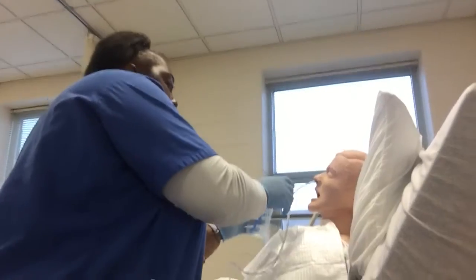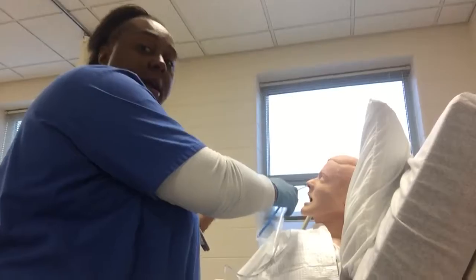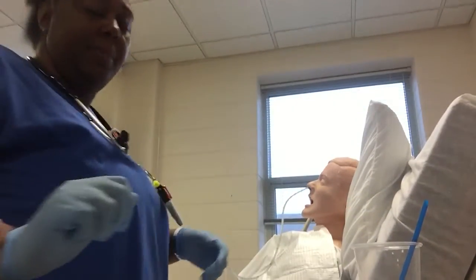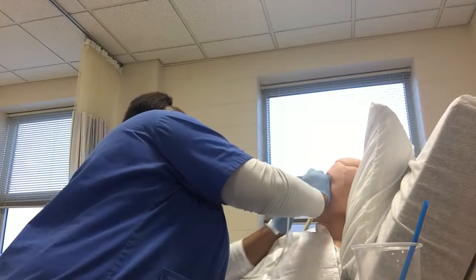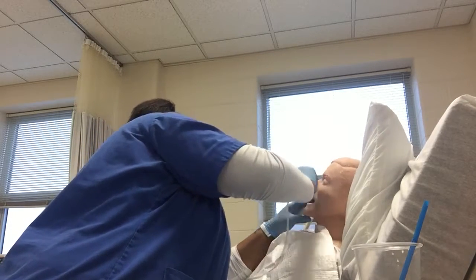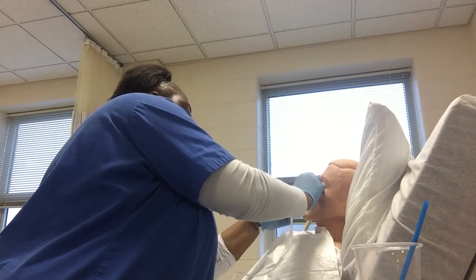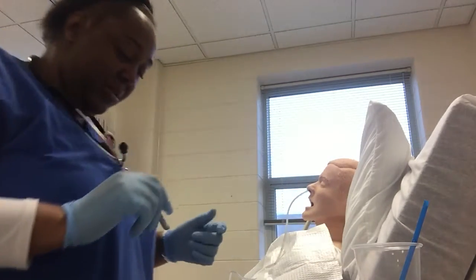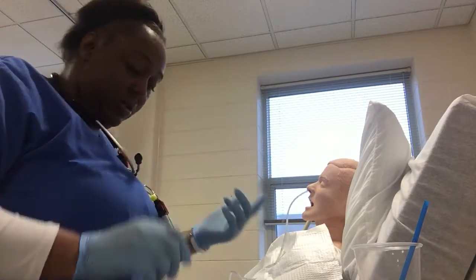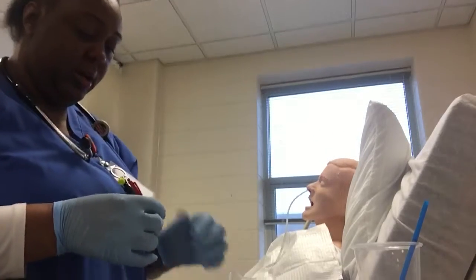Once I get that to the back of the neck, give the patient some water, and then tell them they can relax their head, and they can take some sips of water to help the tube go down. Okay, so this mannequin is not allowing me to completely go down the throat with the tubing, but like I said, I would go down to 39.